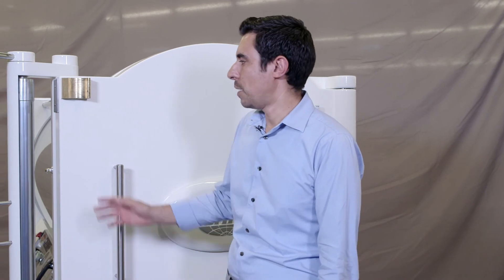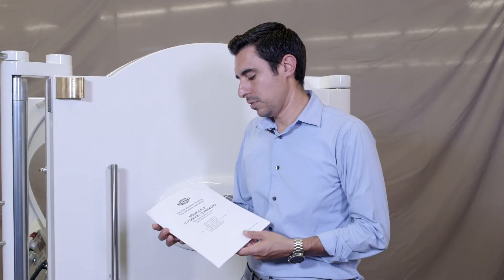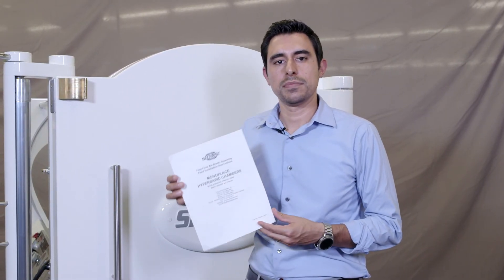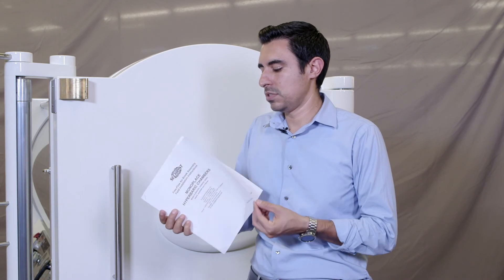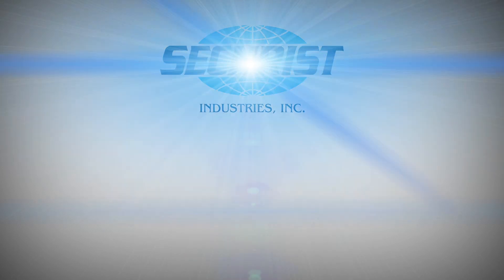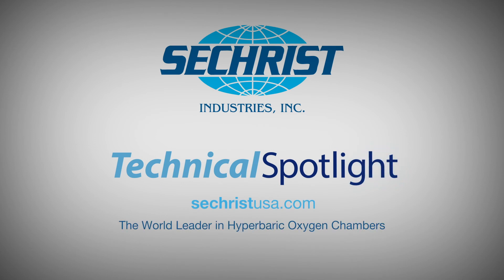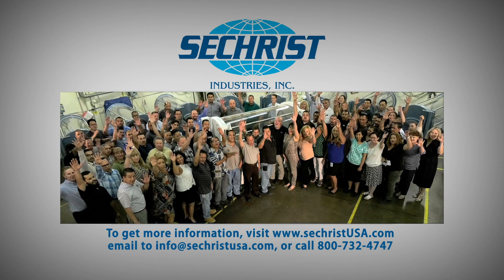We hope that these two options — the door ring pass-through installation and the door plate pass-through installation — have been helpful to you in order to install your Sechrist Free-Flow Air Break Assembly Kit. Your full kit also provides installation instructions with details on how to install both options. To find out more about our full suite of hyperbaric products, please visit us on the web at www.sechristusa.com. Our team is standing by to serve you.